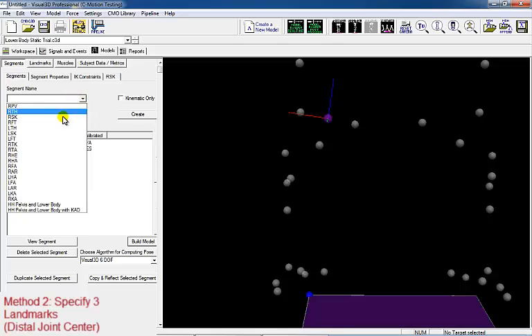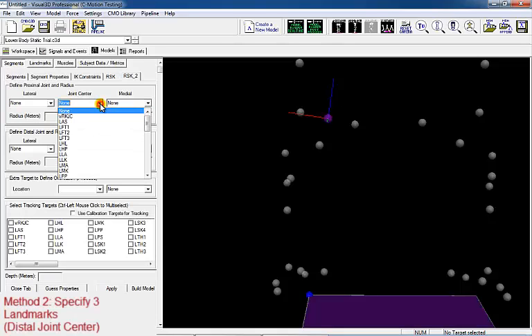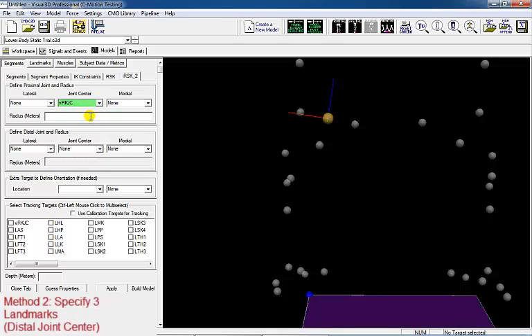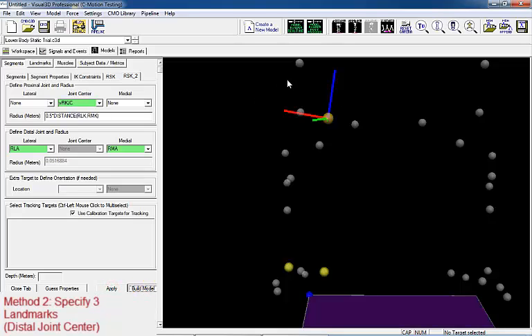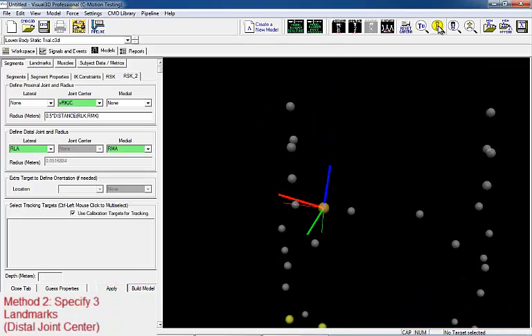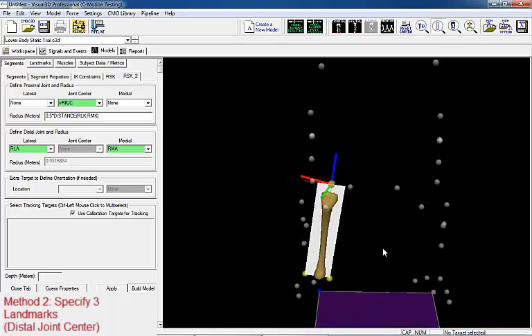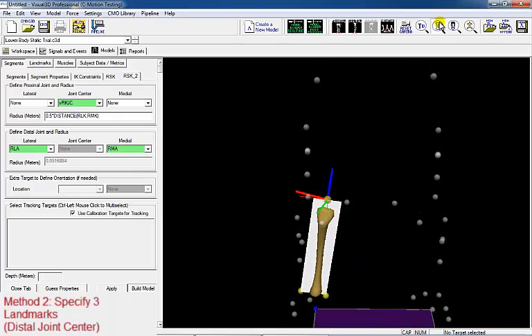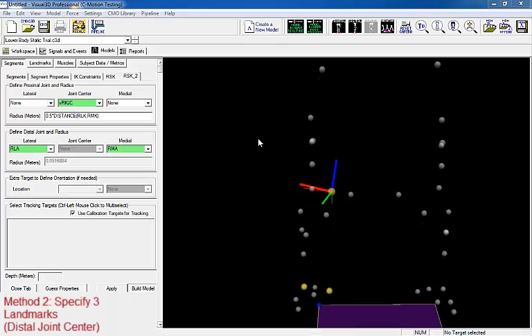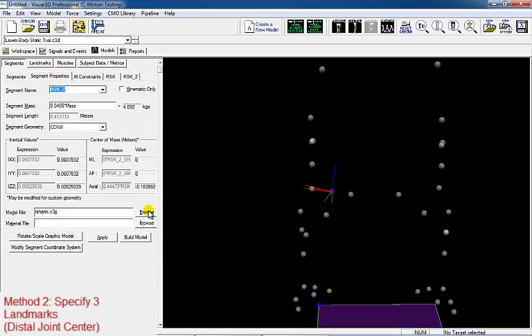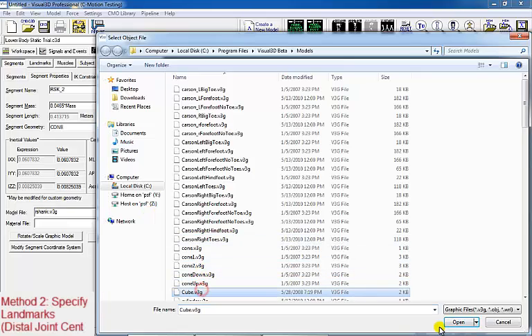Now we're going to create a second shank segment off the virtual knee joint center and the two ankle targets. For the proximal end of the segment, we'll set the radius to one half the distance between the lateral and medial knee targets. For the distal end, we'll define the lateral and medial definitions as the ankle targets. Select Use Calibration Targets for Tracking, Apply and Build Model. You can see there is now a new segment coordinate system that has been added. Notice that this new segment coordinate system is externally rotated compared to the original, because our frontal plane has been defined differently.